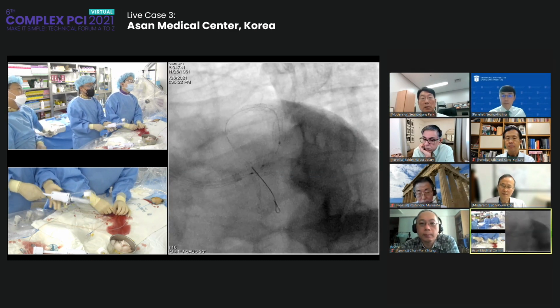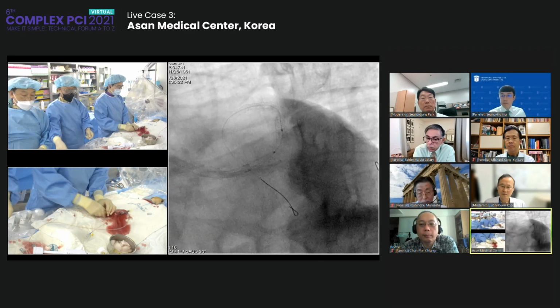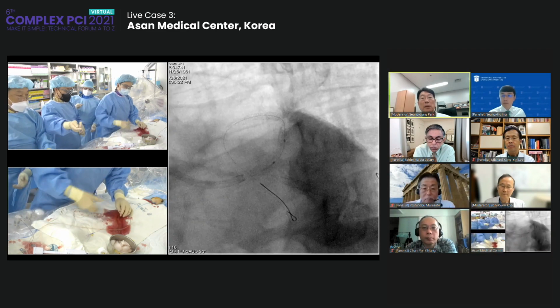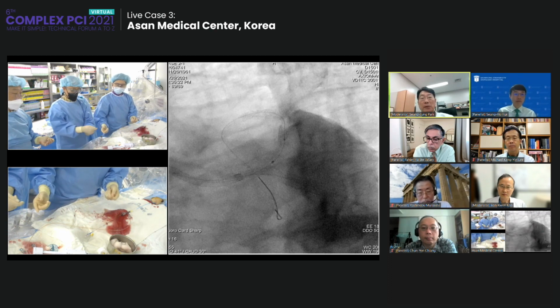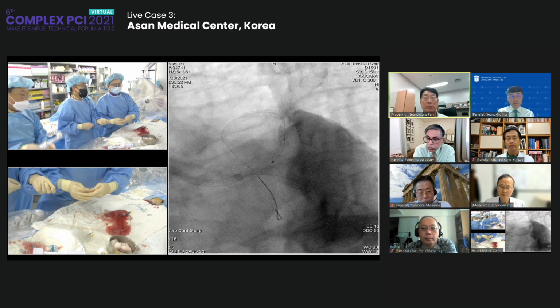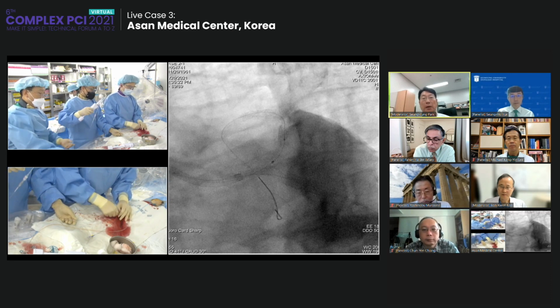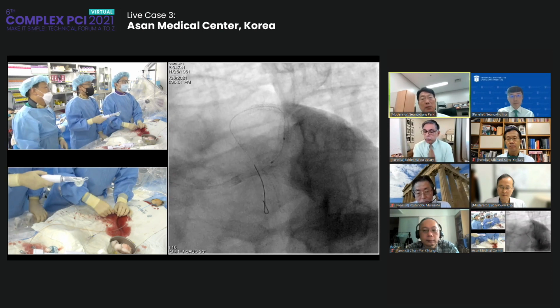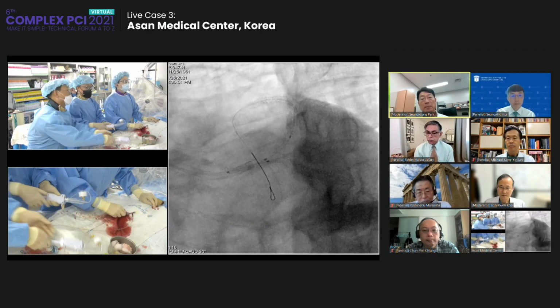3.5 NC, please. The decision making in this patient is so complex, but the procedure itself is very simple. However, conceptually, Dr. Gu explained that LAD disease is a very diffuse disease, with gradually decreasing FFR, a fragile part. However, I think the proximal part is a big vessel, a major part, so we want to fix the proximal part first, and then we may need FFR again after this.